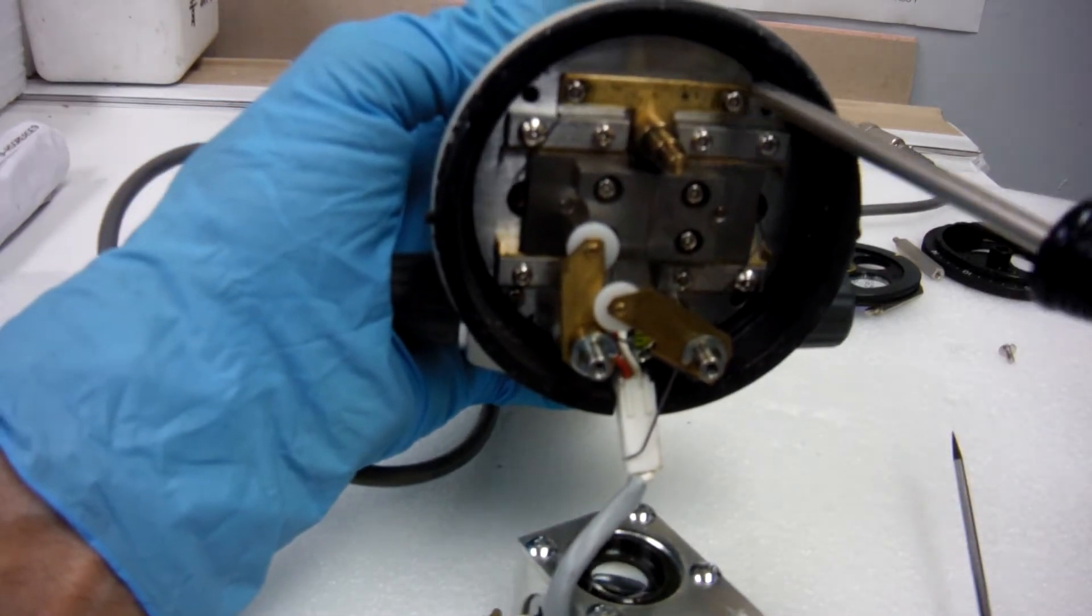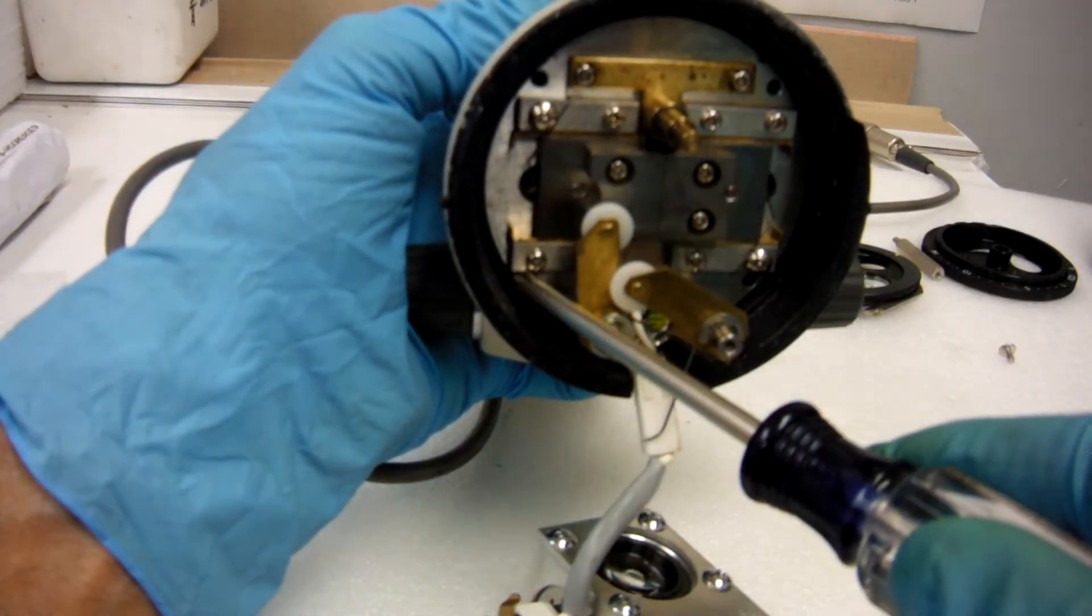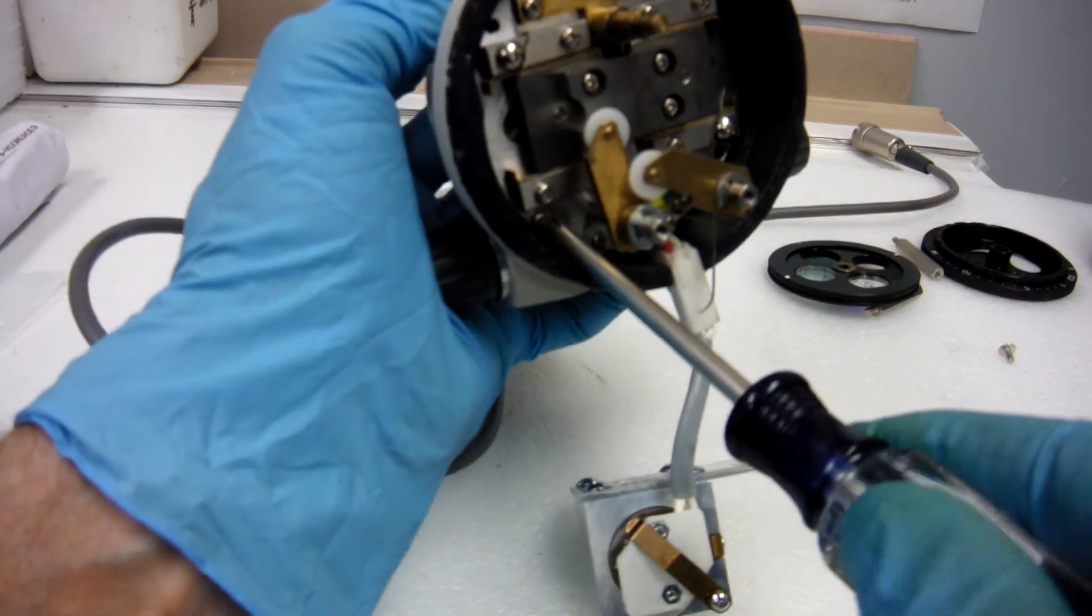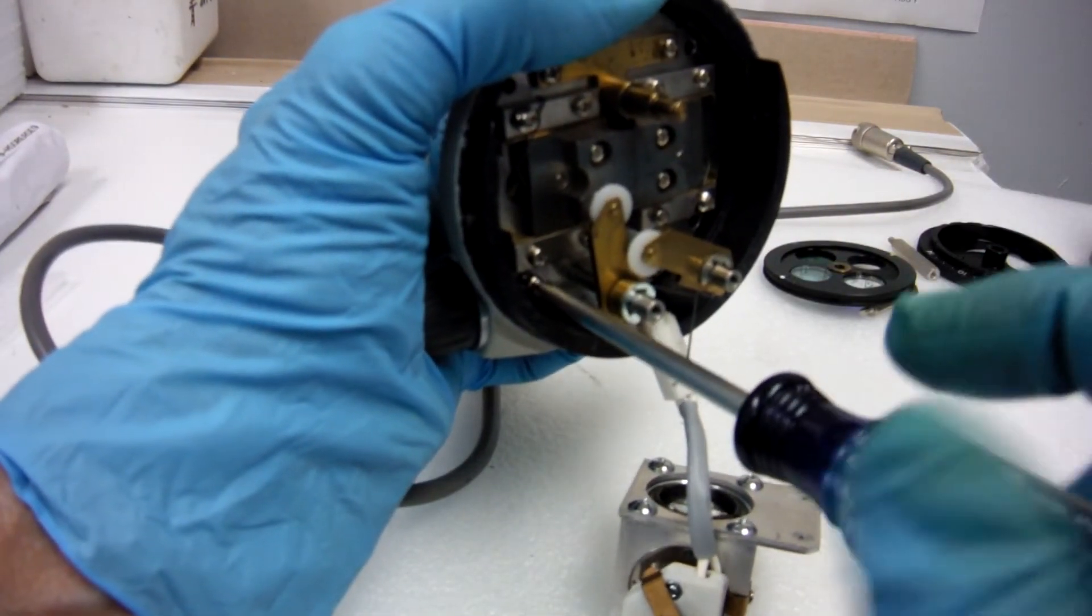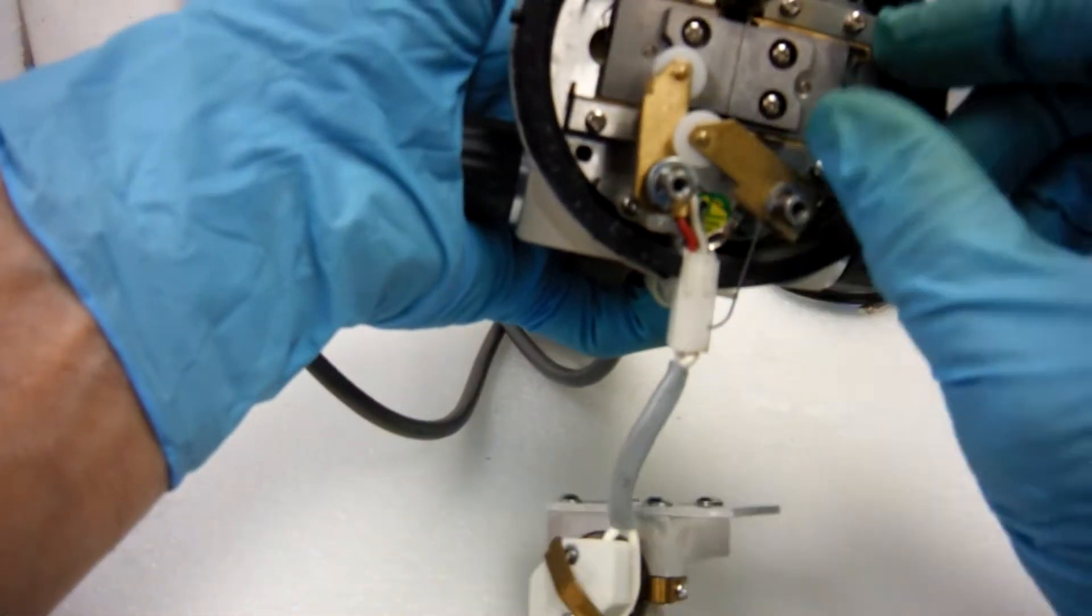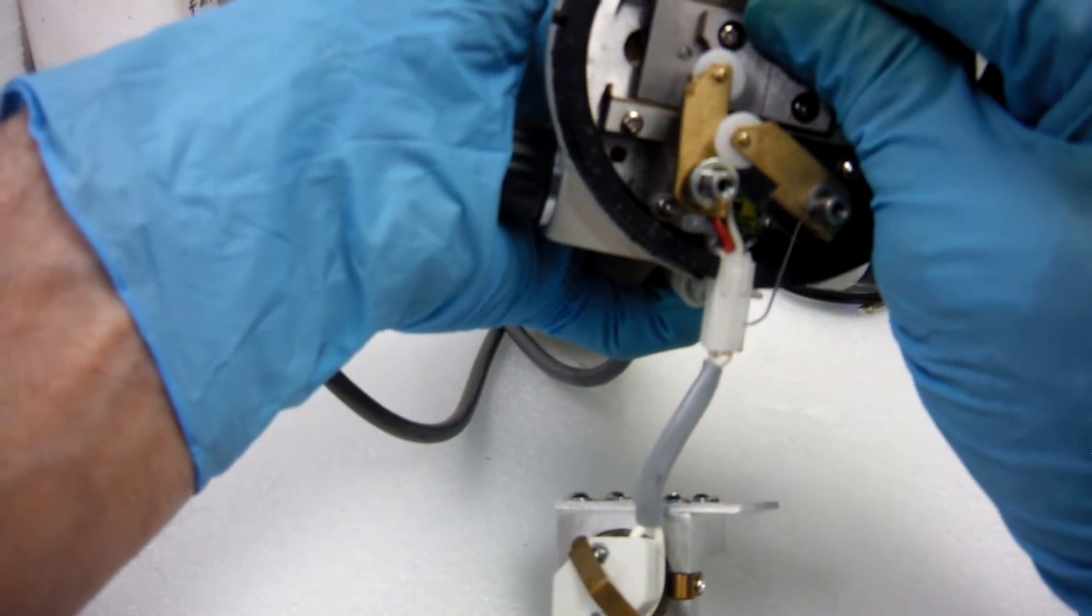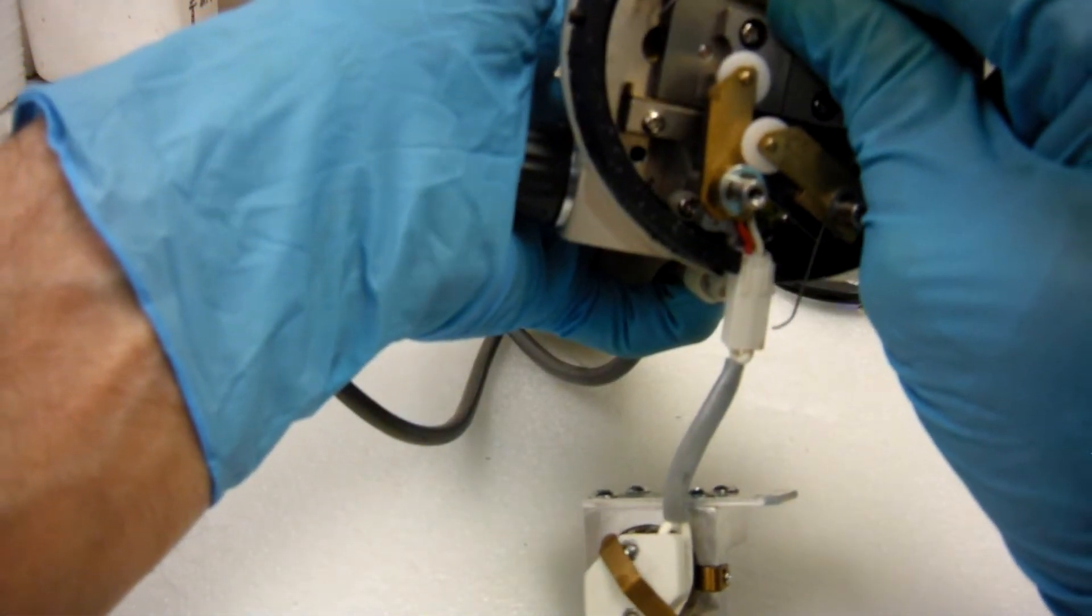Next, take out four screws. I've already taken three of them out. This is the fourth one. Put those four screws out. This assembly should come on out.